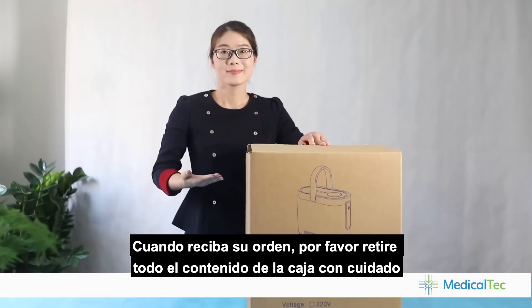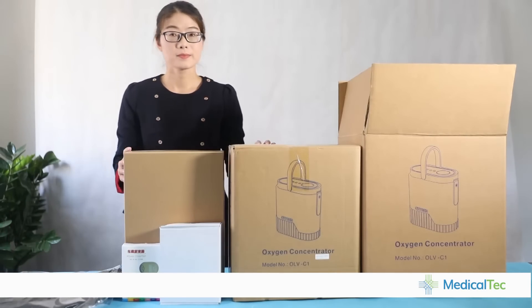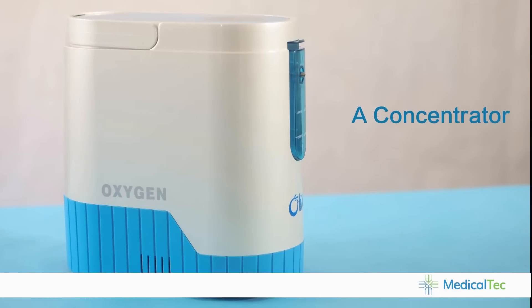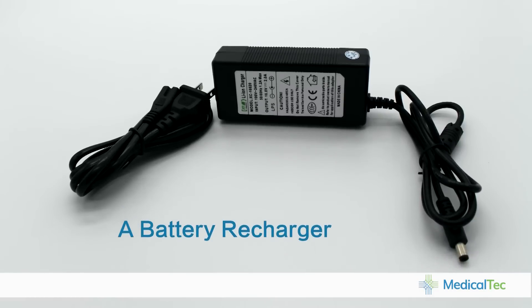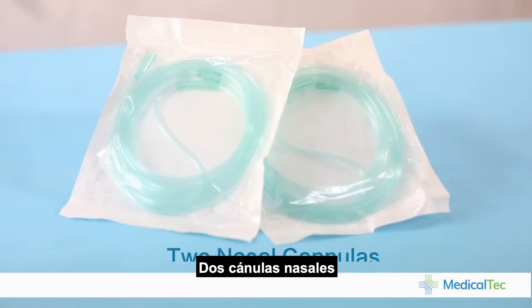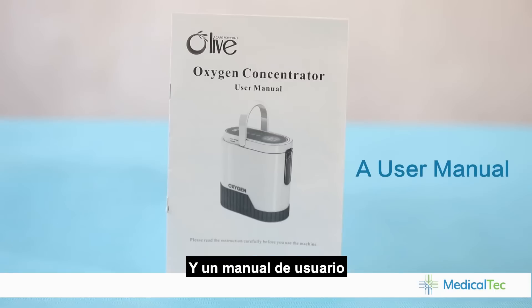We received the order. Please carefully remove all the contents of the box. The box should include the following items: the concentrator, a car inverter, a battery, a battery recharger, a carrying bag, a portable trolley, two nasal cannulas, two filters, a power cord, and a user manual.